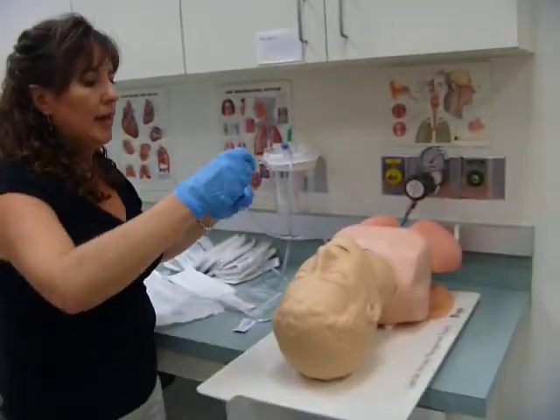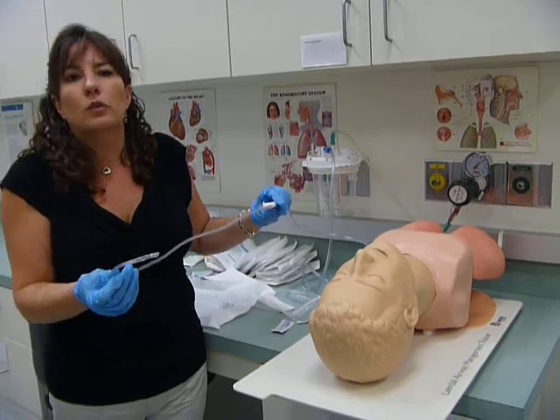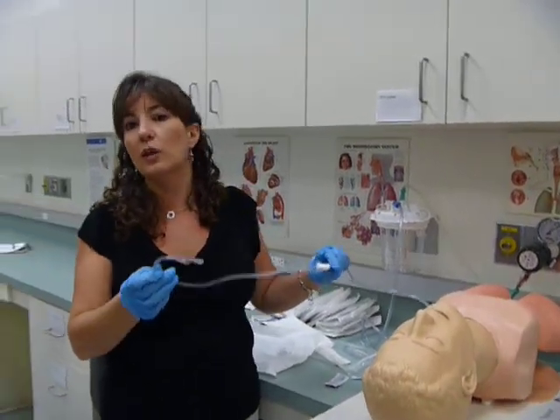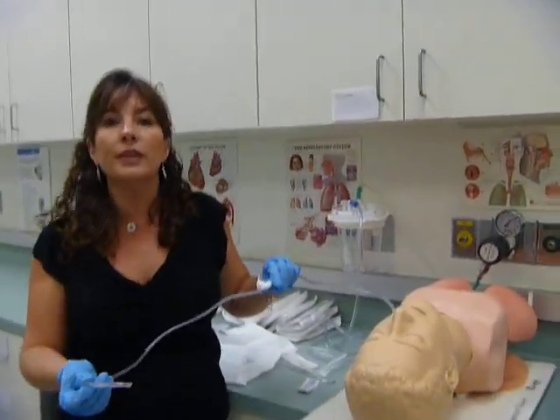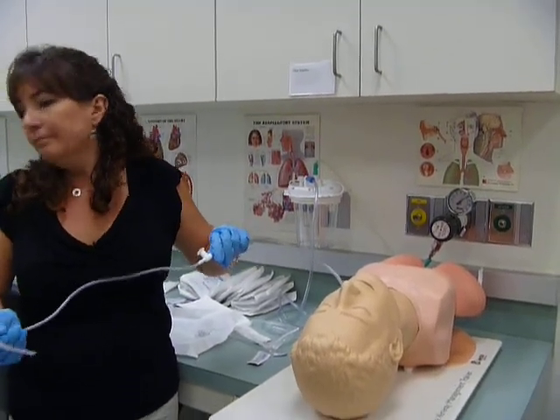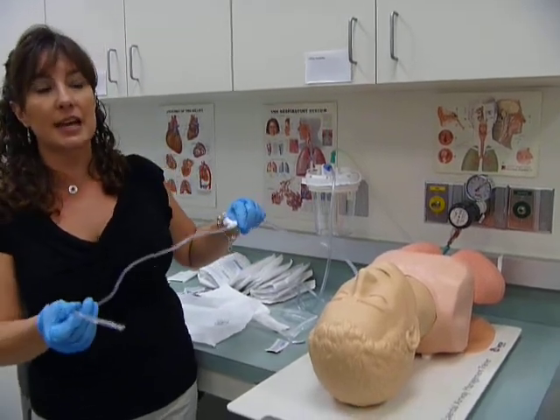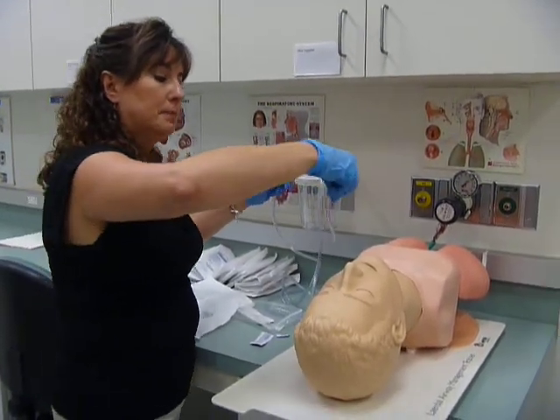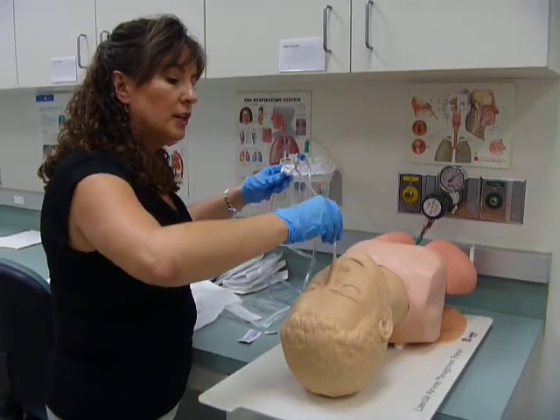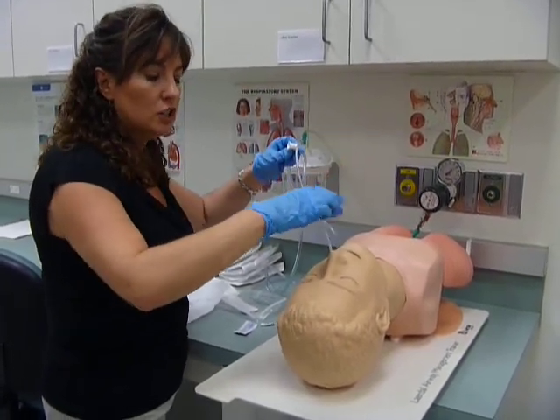Okay, and insert it depending on which nare is free. If they have a nasogastric tube in their nose, you're going to go in the opposite nare. If you didn't have anything in either nare, just pick the one that probably looks the least damaged. So I'm going to insert it. And again, don't touch his nose.